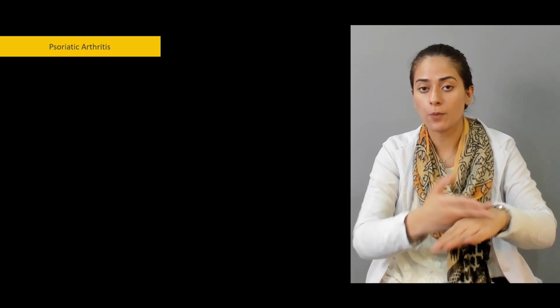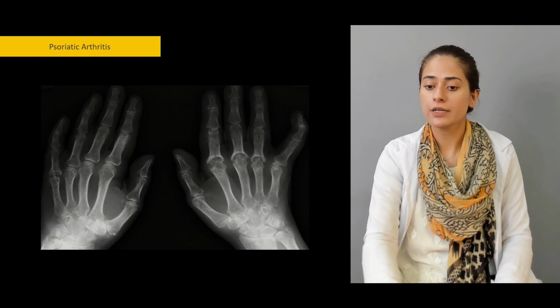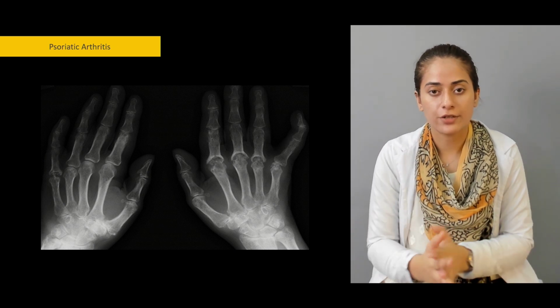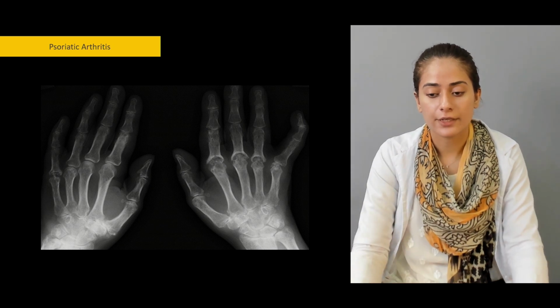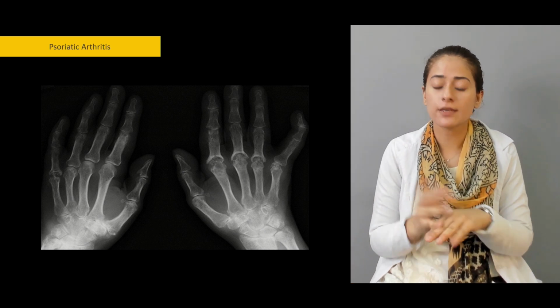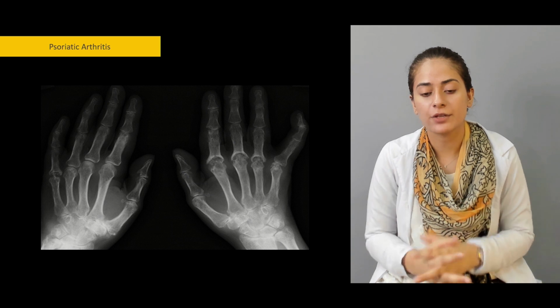So it is more painful, and the movements will be much more limited and much more painful than they were in simple osteoarthritis, when only the bone was involved. Now the bone and the skin on top of the joint are also involved. So let's see how that appears. The skin can't be visible on a radiograph or X-ray, so we can't really see the psoriatic changes on the skin. But like I said, it will be reddish skin with a silvery, scaly appearance.